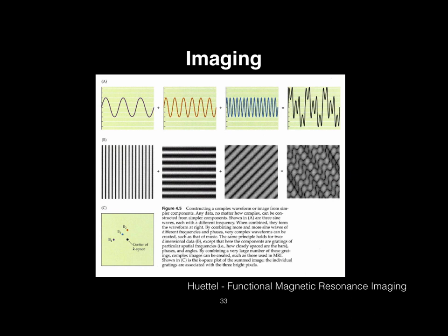And if you look at what variation or what waveform B3 represents, it now has some variation both in x and in y. So now it's a kind of diagonal pattern. As you apply your gradients and your encoding, you're essentially combining things that have these sinusoidal variations across this grid that you're acquiring.